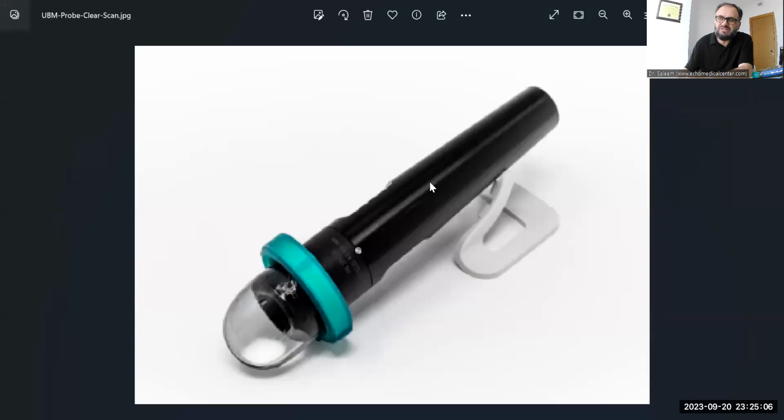This one we see, so this is a transducer. This is a water path. So this water path is actually giving you a distance. It lets the crystal vibrate to send the pulses to that tissue where you want to see, and then they have more time or more distance to be listened to.